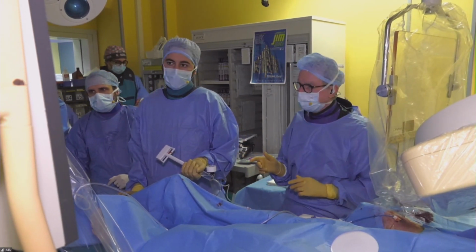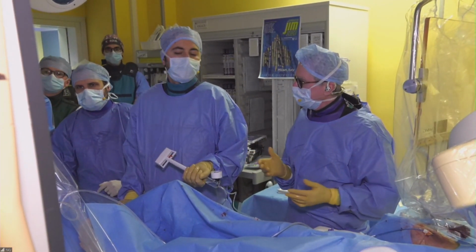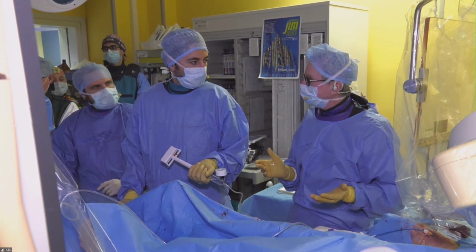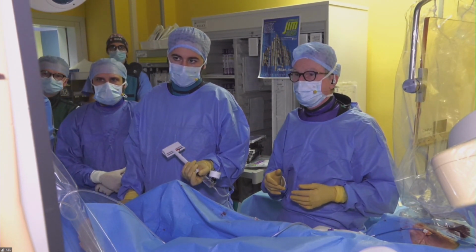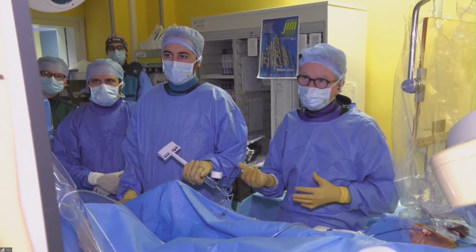And then we did the pressure gradient distally. Baseline was 86 and the RFR was 78, so clearly positive. So we stented the distal lesion with the 2.5 stent. I wanted a 12, but they didn't have a 12. We had to place the 16, but it's okay.